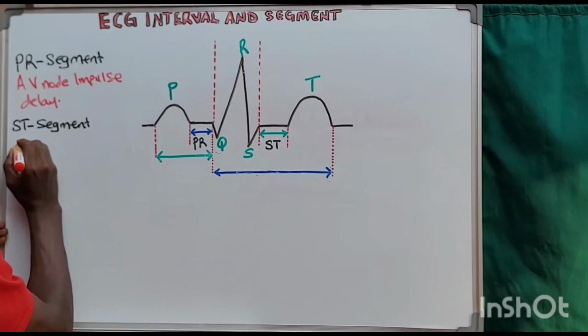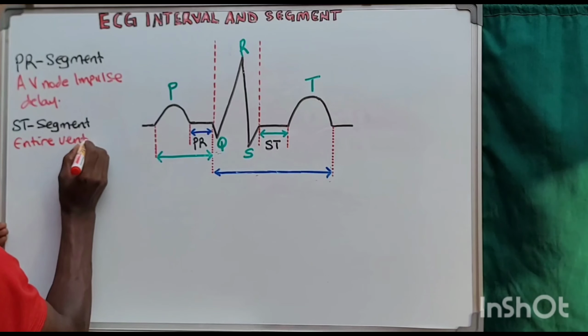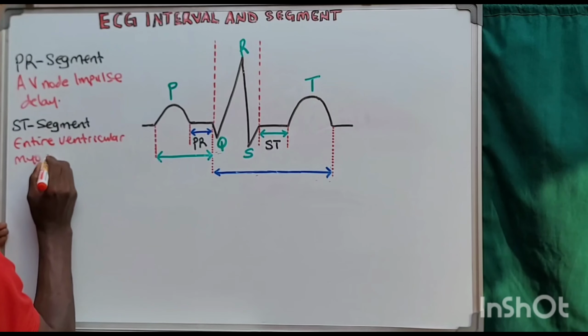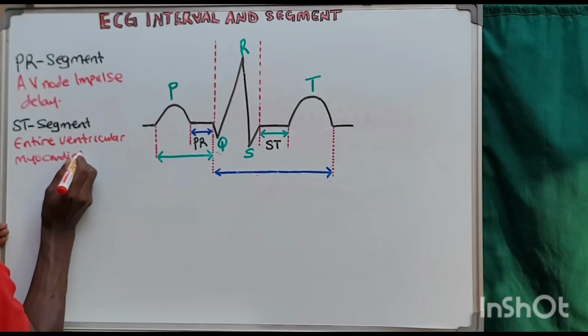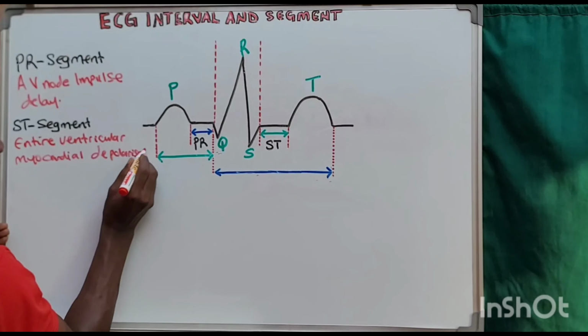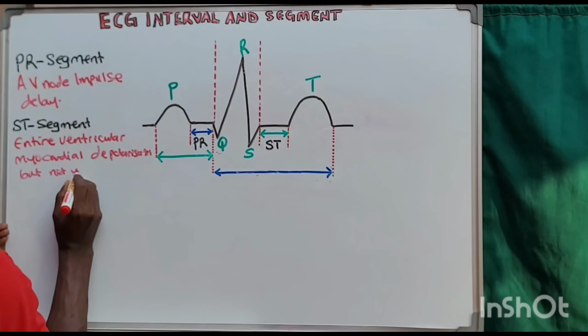Okay, it represents entire ventricular myocardial depolarization.